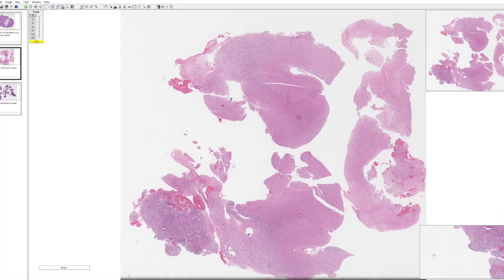And as we learned in episode 1, hematoxylin labels DNA and therefore highlights nuclei, whereas eosin labels proteins and therefore labels cytoplasms that are usually protein rich, pink.